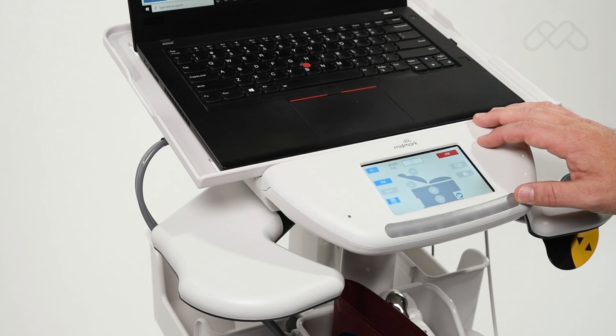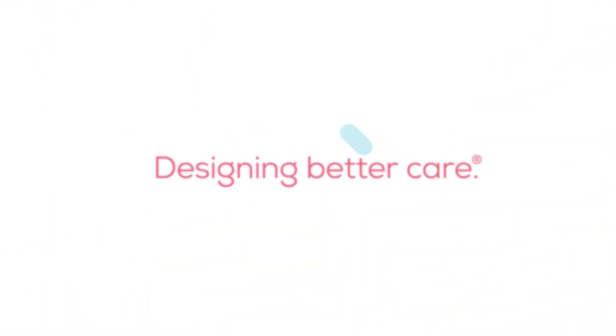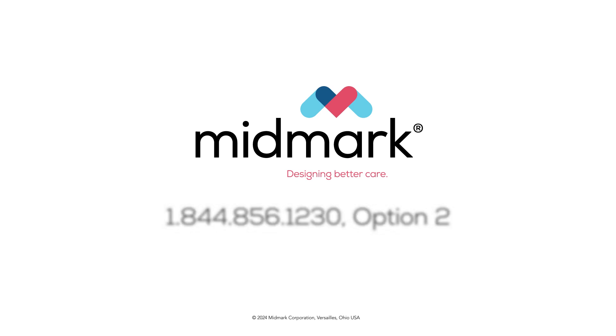For more detailed information about vitals capture using your device, please refer to the IQvitals Zone user guide. For further support, contact Midmark technical support at 1-844-856-1230, option 2.